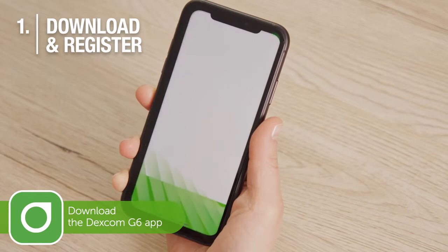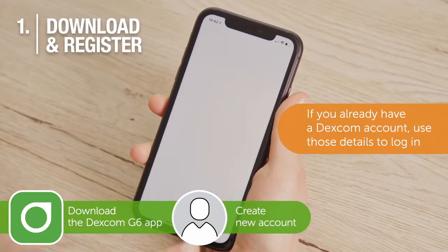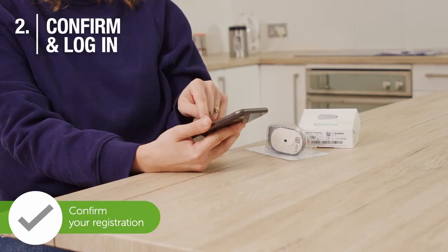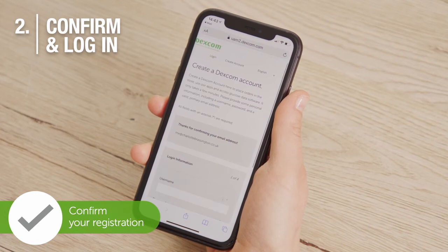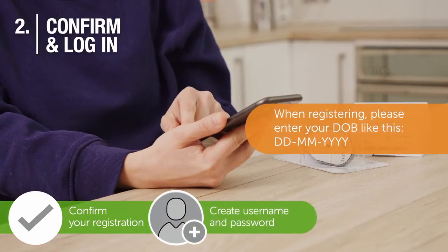Download the Dexcom G6 mobile app and create an account. You'll be sent an email to confirm your registration. Press the green 'Confirm My Email' button. If your email is not in your inbox, please check your spam.